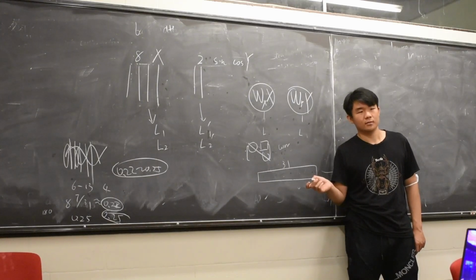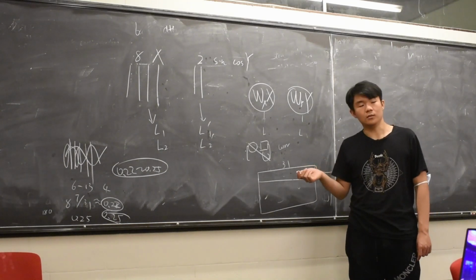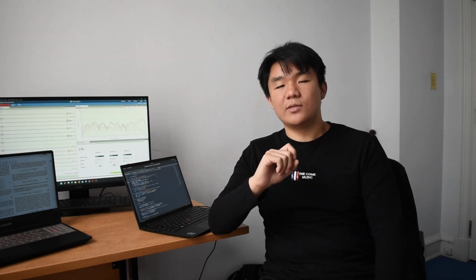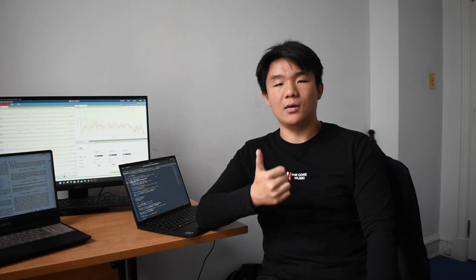And increasing the range of frequency and keeping the highest frequency low makes this process easy. The clean signal is then passed to the CCA, or canonical correlation analysis, to figure out which flashing frequency correlates the best with the measured EEG data. It's also worth mentioning that CCA works really well because correlation is much more robust to short signal length and very small frequency gaps when compared with other related methods such as power spectrum density.